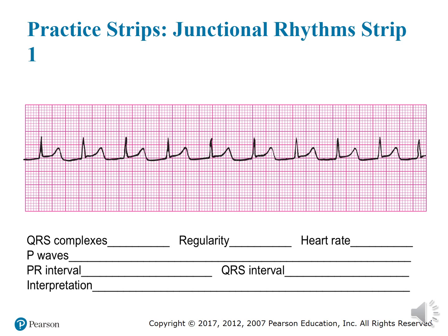Well, are there any P waves? No, NA. Let's really, really look. I don't see any after. I don't see any inverted, but our heart rate is 100. So NA. Therefore, we don't have to figure out our PR interval because we don't have any P's, so we would put NA.